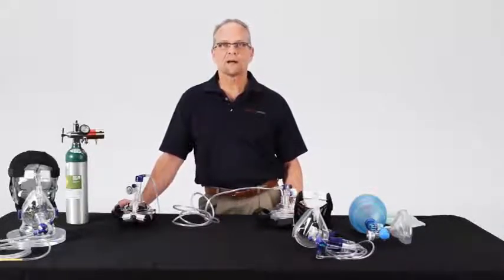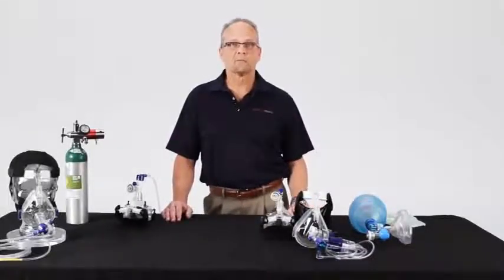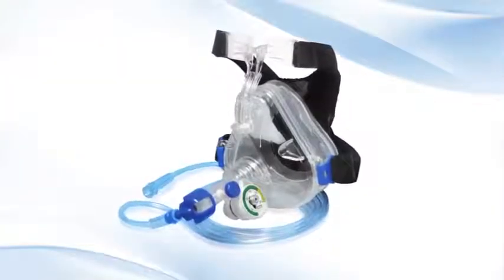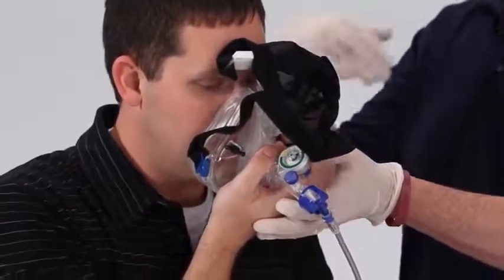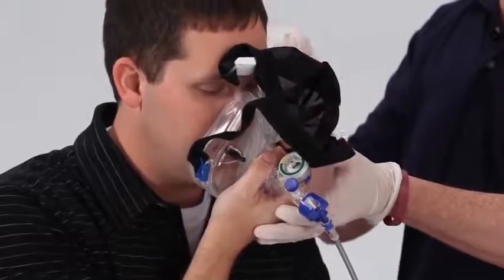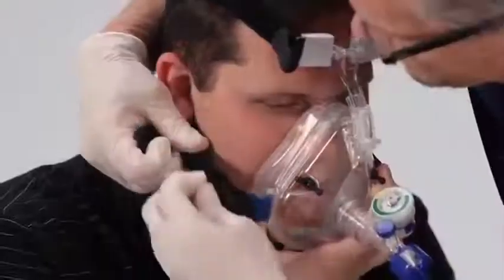Remember that patients who are CPAP candidates are in distress, not in failure, so you have some time to set up and explain the procedure. Most patients like to be in charge, or at least feel like they have some say in what's going on. With the deluxe mask, I find it's best to pull the head harness back over the mask, allowing the patient to hold the mask to their face without the harness on. This is when coaching is at its premium. Keep a hand on the mask, allow them to pull the mask away in the beginning, and slowly use your hand to hold the mask in place. Once they allow you to keep the mask on, pull the harness over their head and tighten the Velcro.